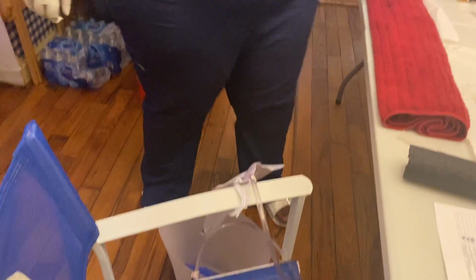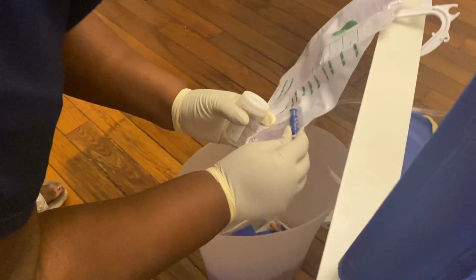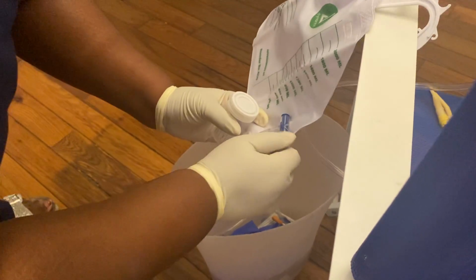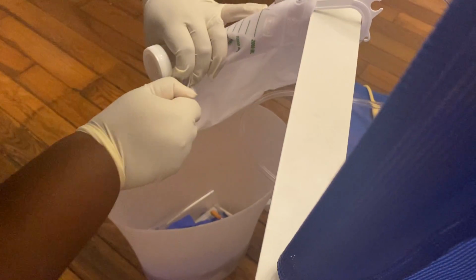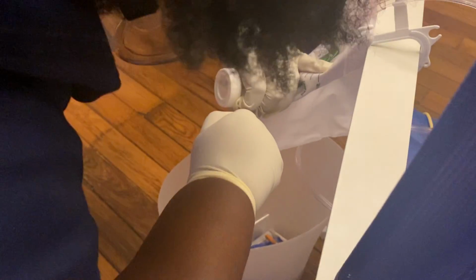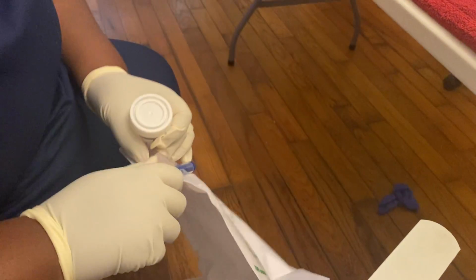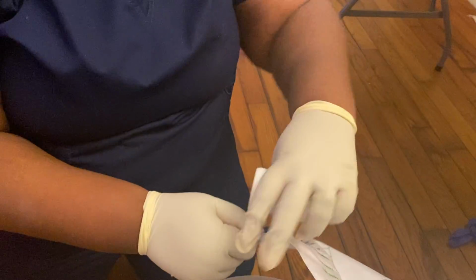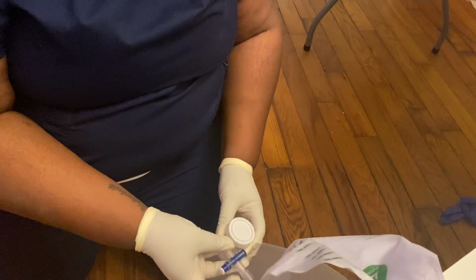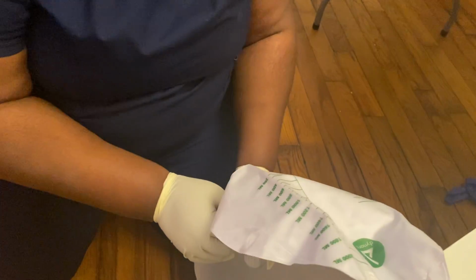Okay. Then I'm going to take my specimen. And then I'm going to place it in here without touching the outer cup inside the rim.